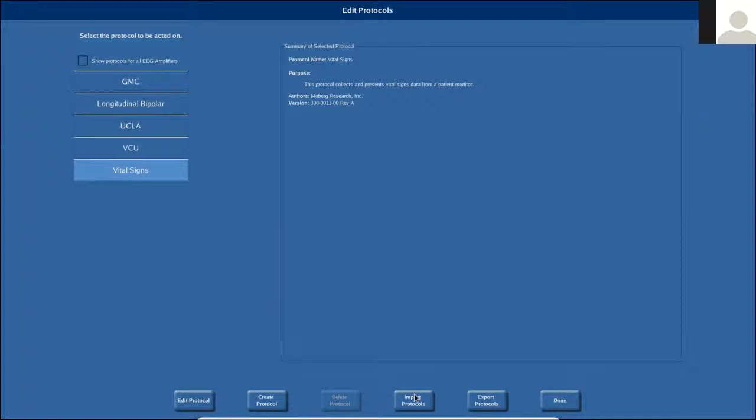And we have some technical bulletins that we can share with you, walking you through the specific steps of that.